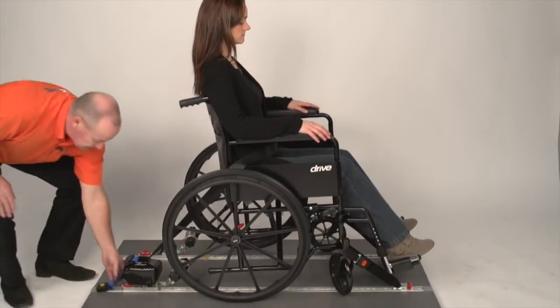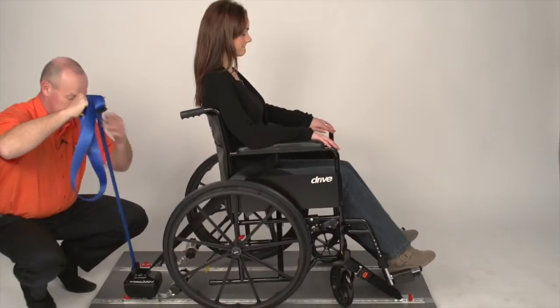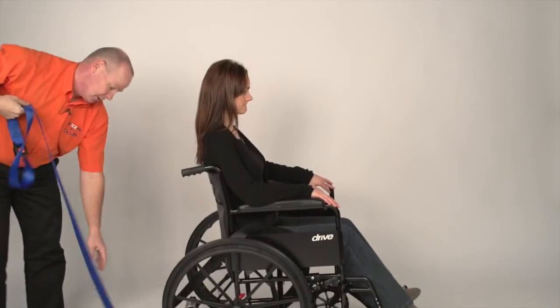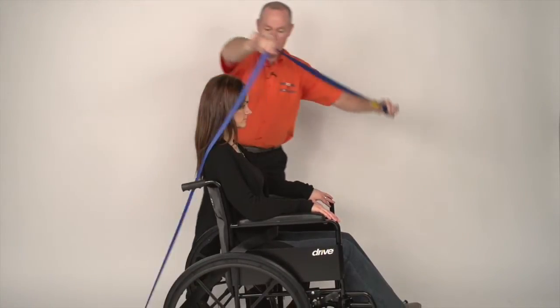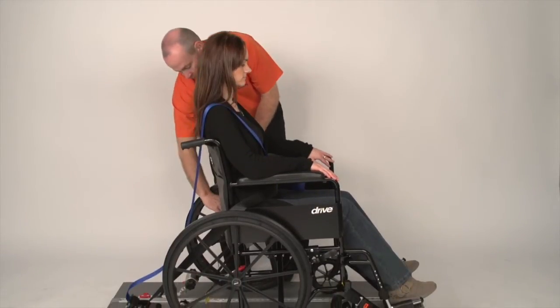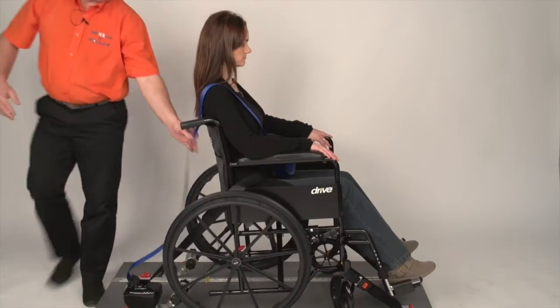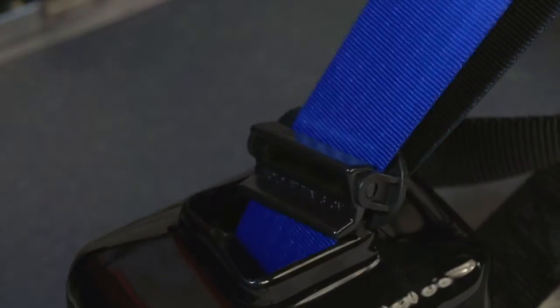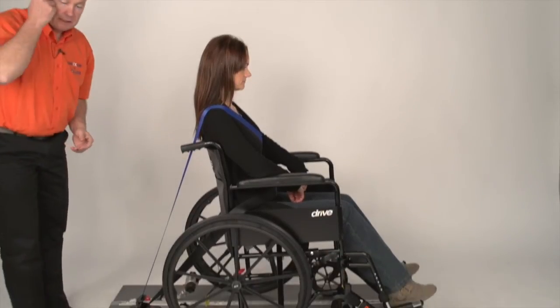Come to the blue side, take all of the blue reel out, squeeze the top of the clunk clip together — this will prevent it going back into the reel. Take hold of the reel, bring it over the shoulder, underneath the armrest, and put the tongue into the buckle. Taking control of the webbing, release the clunk clip, bring it down onto the shoulder and allow it to go back in.